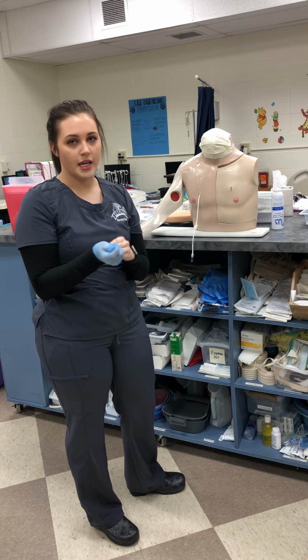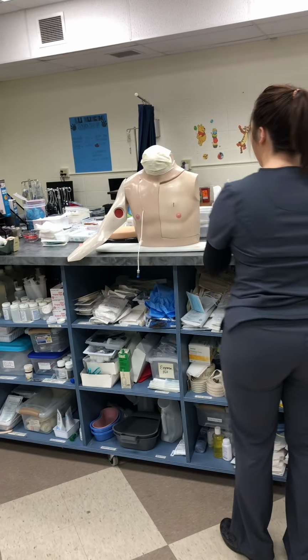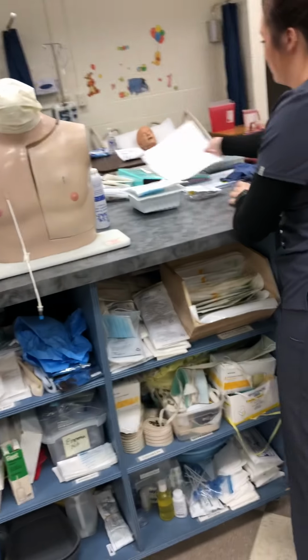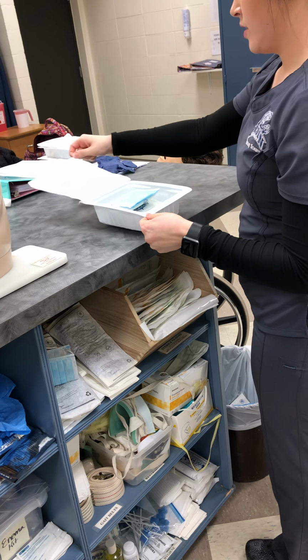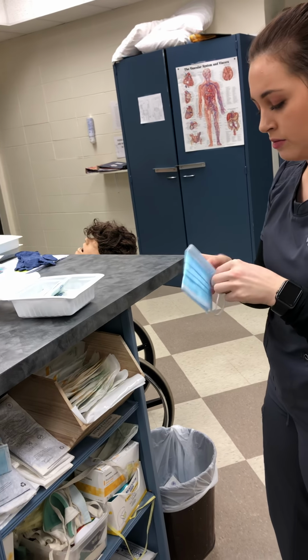I'm going to wash my hands again, and I'm going to access my sterile field. So washing my hands. Okay, I'm going to open my sterile dressing kit, and I open that away from me. The first thing on top is my mask. I'm going to go ahead and pull that out and put that on.